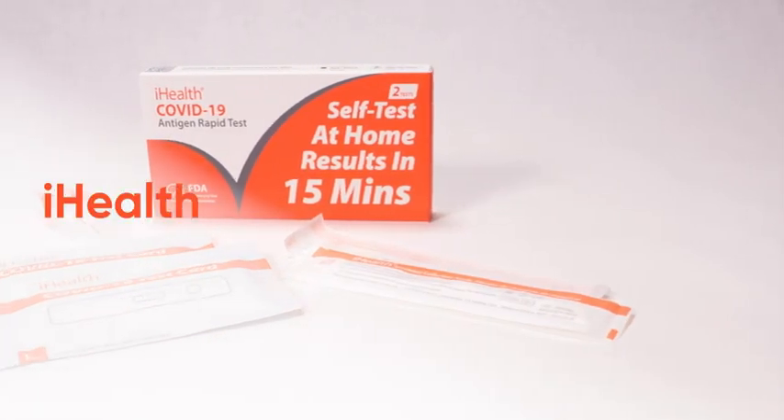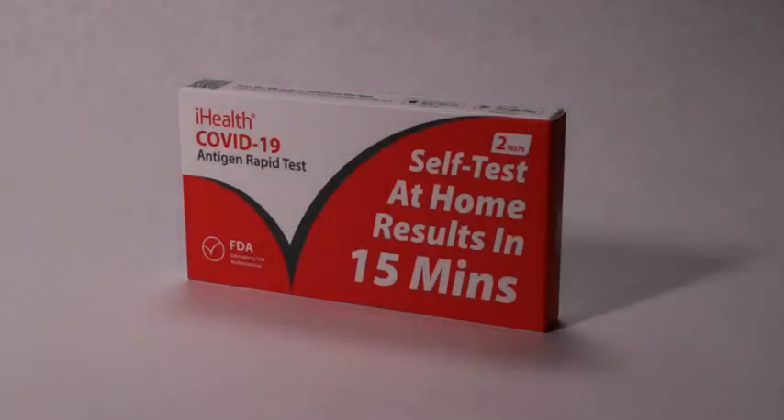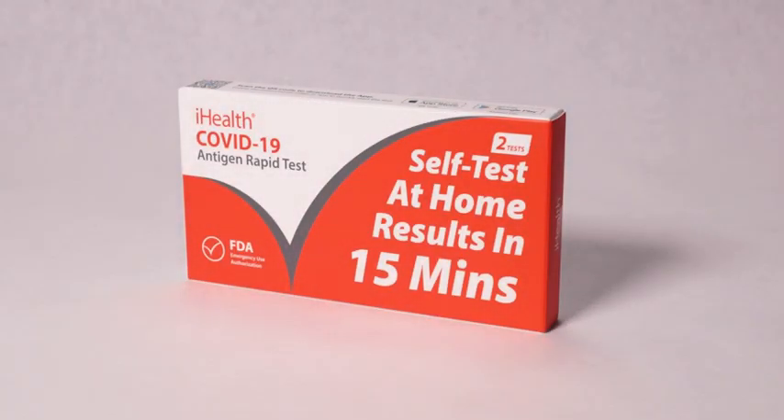Welcome to the instructional video for the iHealth COVID-19 Antigen Rapid Test. Let's learn how you can complete the test all by yourself and read your results in just a few minutes.